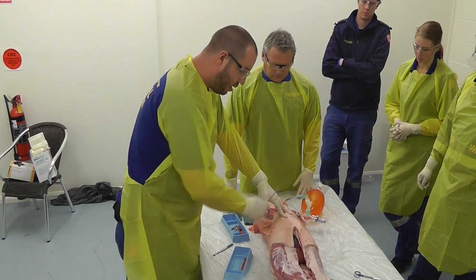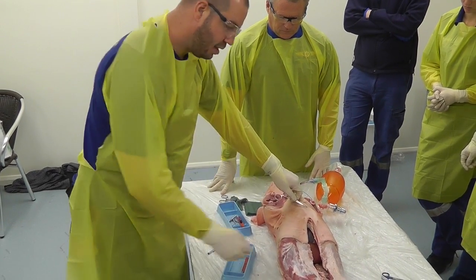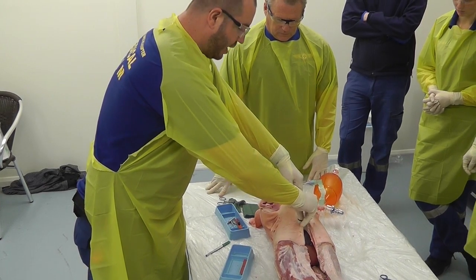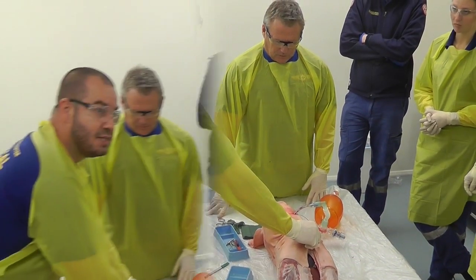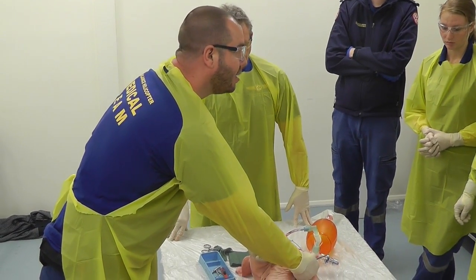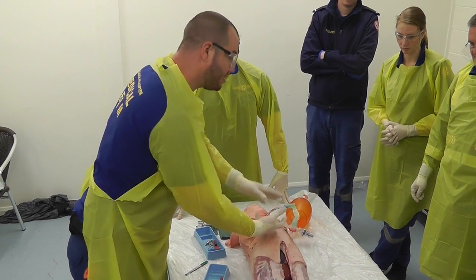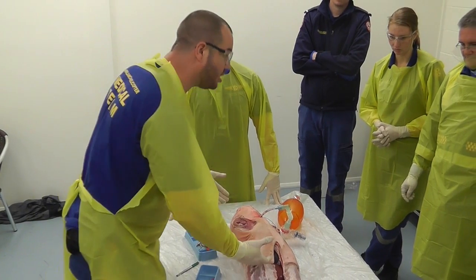You will have a heart in the pericardium and two lungs. You are going to pick up that pericardial sac — quite fibrous — get either some scissors or your tough cuts, make a bit of a cut through that, then make an incision horizontally or vertically. There are two phrenic nerves that go on either side of the heart — you don't want to knock those off if you get this patient alive again. Make a vertical incision and deliver that heart out. If there is clot in there, get the clot out.